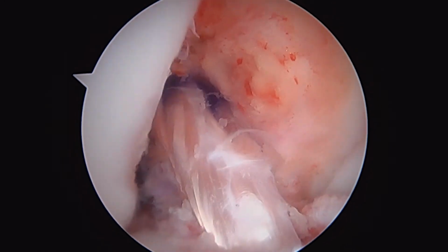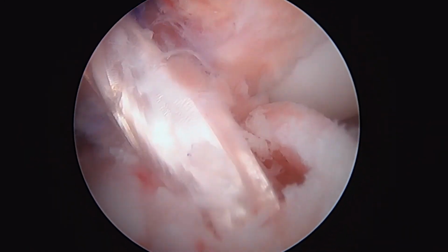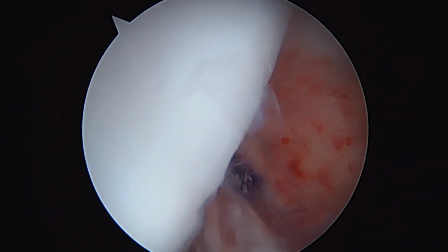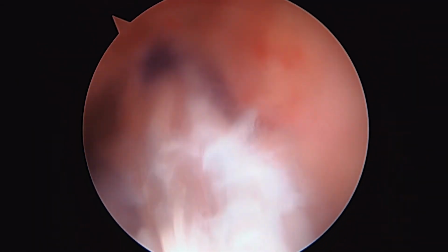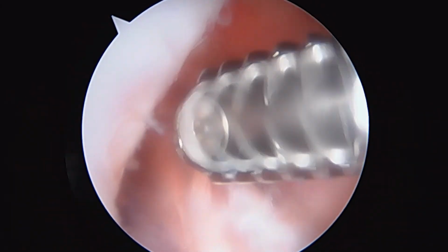Okay, so there's the graft. It's fixed on the tibial side. You can't see the screw, but the tip of it is just below the surface right there. And it's fixed on the femoral side with an endo button. That looks real good. I'm happy with the way that looks. We're just going to flush the knee out, and we're going to close the incisions and get you back to the recovery room shortly, okay?